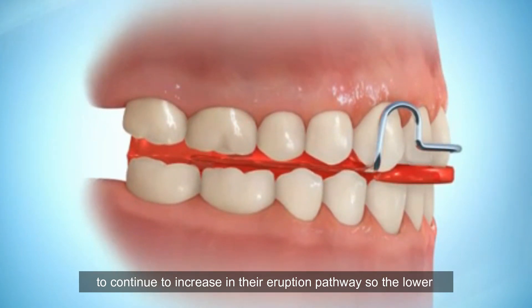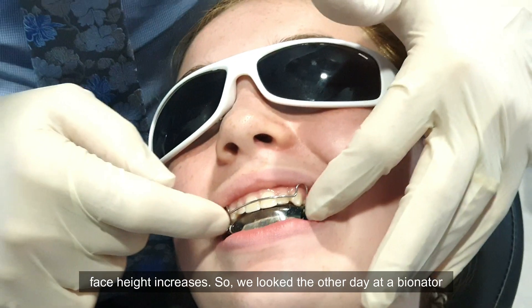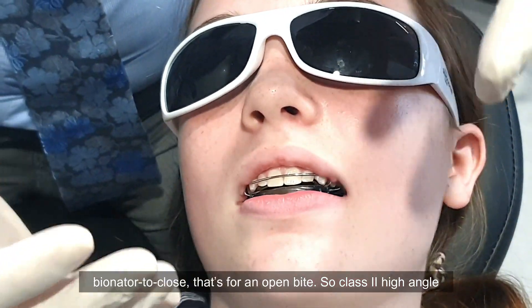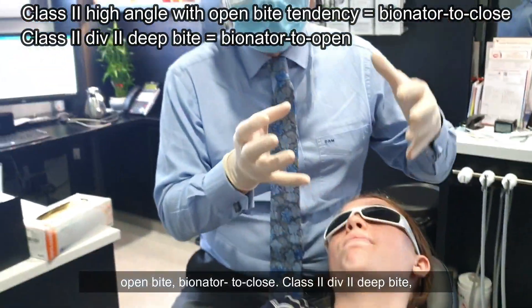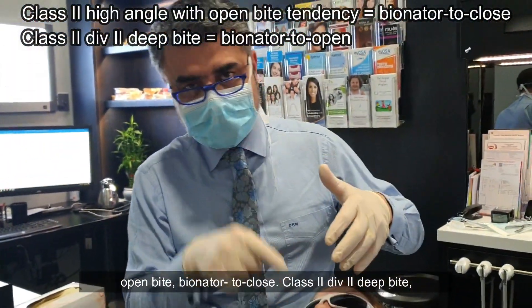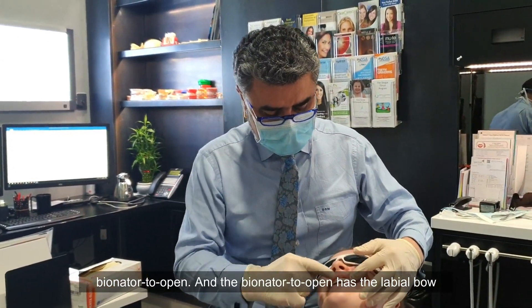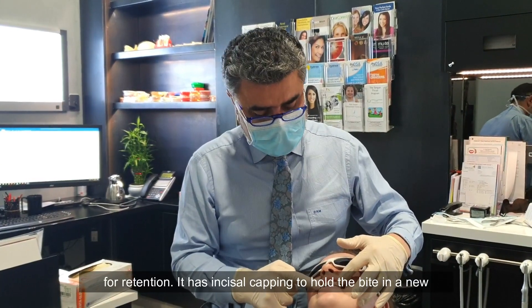This allows the lower face height to increase. We looked the other day at a bionator to close — that's for a class two, high-angle open bite. So: bionator to close for class two open bite; bionator to open for class two deep bite.